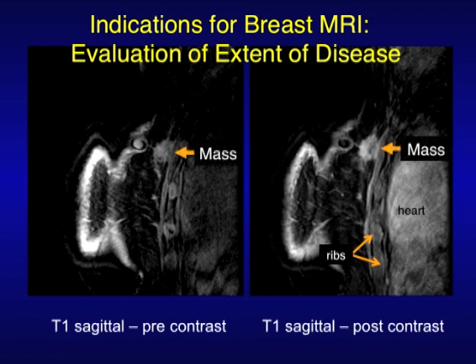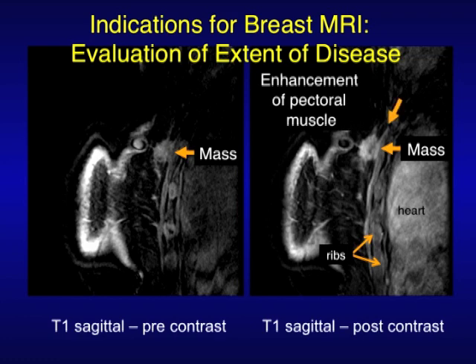Here is the mass after you gave the dye. You can see how it lights up and gets white. And then you can see there's also dye in the heart. And then this here — this little line going up along the chest wall — is actually enhancement along the pectoral muscle.